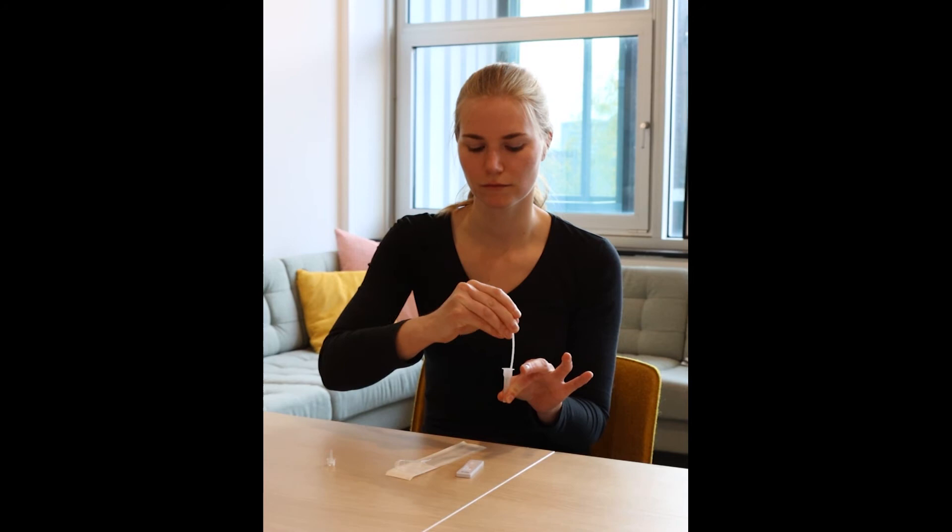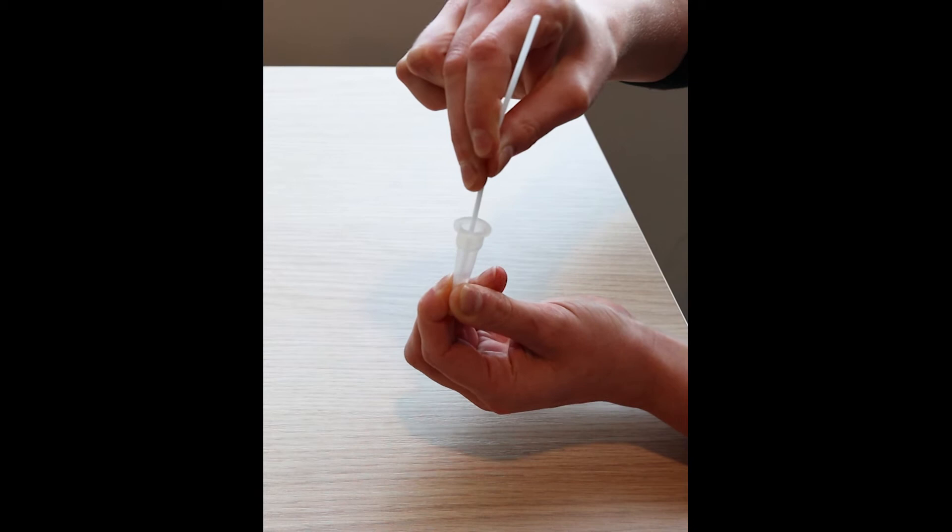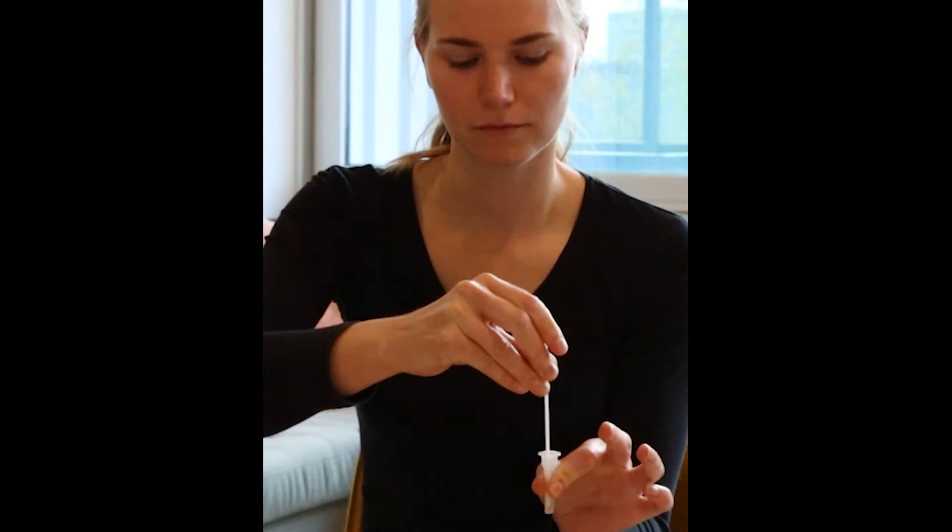You may pinch the tube whilst you're doing this. It is important to mix thoroughly so that you transfer the biological matter from the swab into the liquid. Pinch the tube while you remove the swab to make sure that all the liquid is removed.